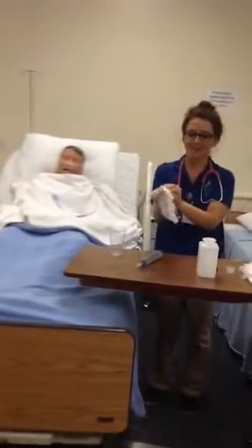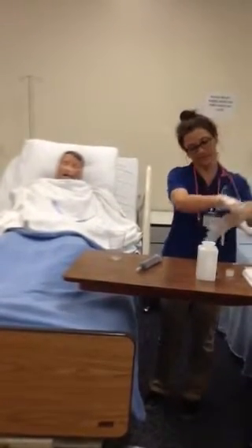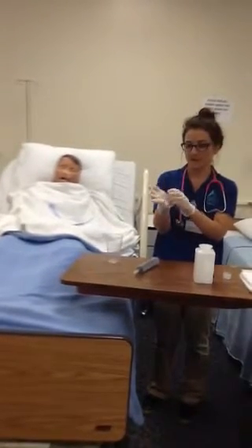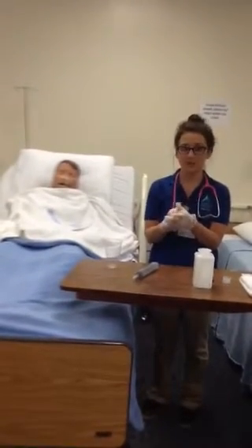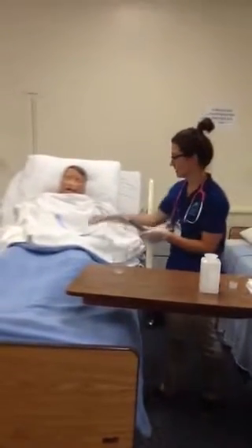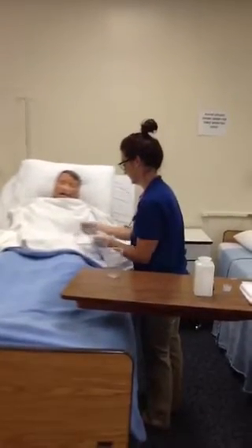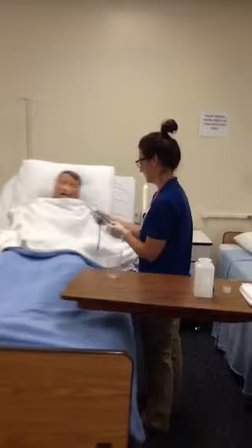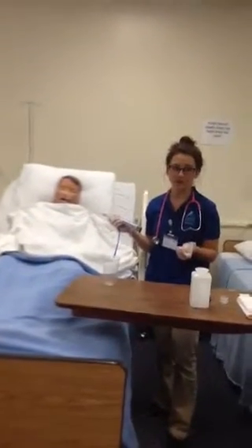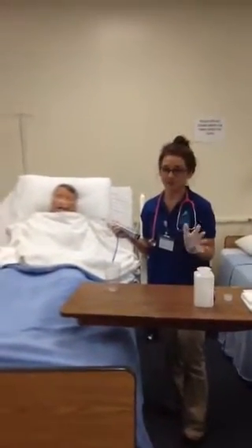I'm going to apply clean gloves. And I've got to check for placement of the NG tube, so I am going to aspirate 30 milliliters of gastric secretions once again. And also, if your hospital does require it and it's part of the policy, we would place the gastric secretions on the litmus paper just to verify the pH.